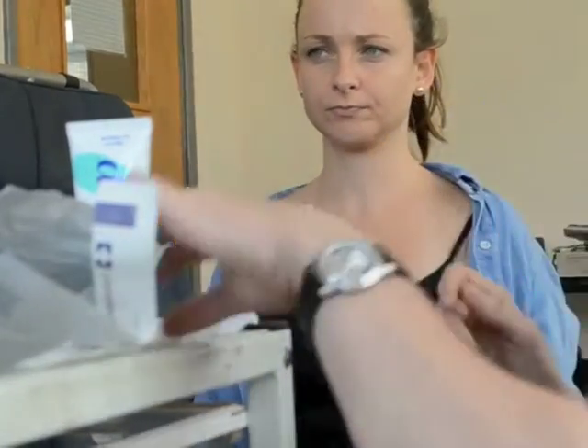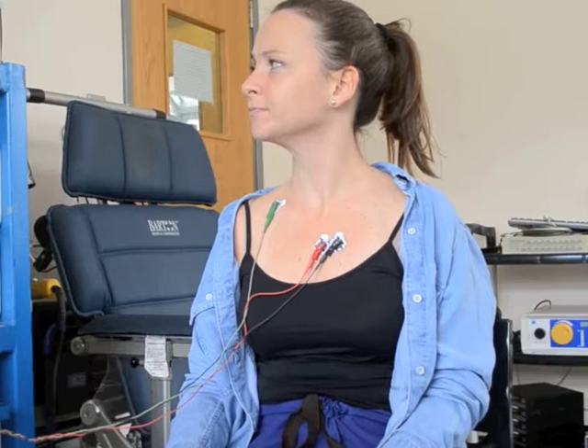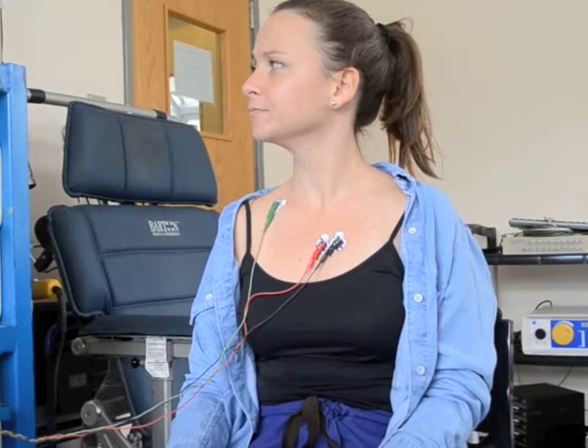The small round stickers on the left side of Monique's chest measure the electrical activity of the intercostal muscles, whereas the large stickers on the right side, forehead and thigh, which you'll probably see later, measure the blood in the tissue below.